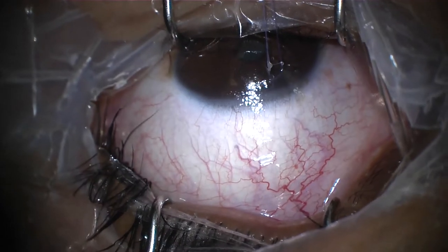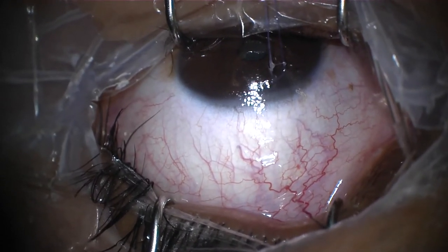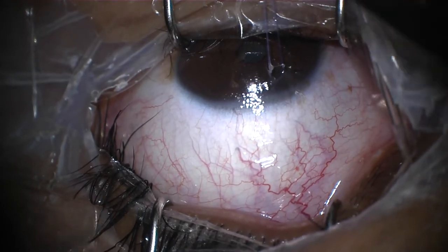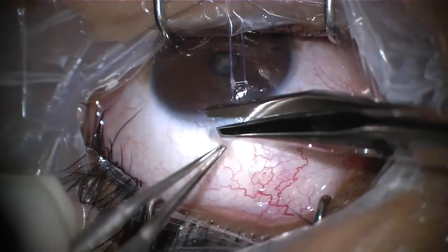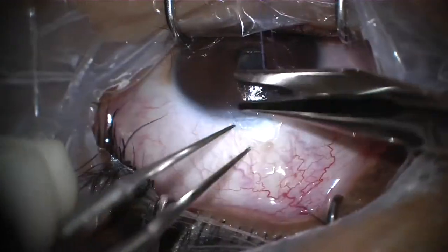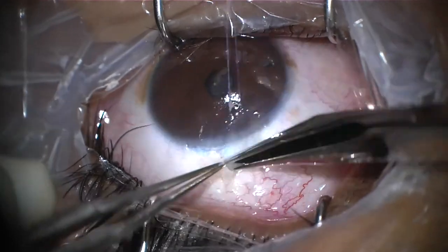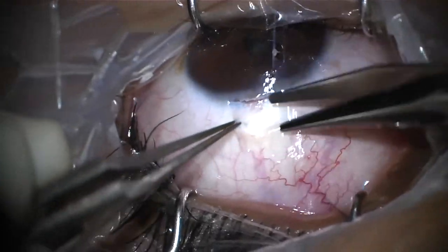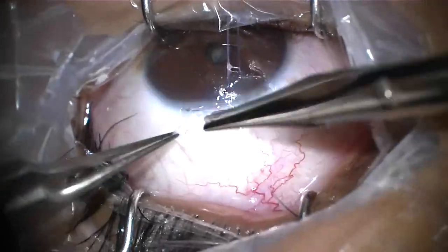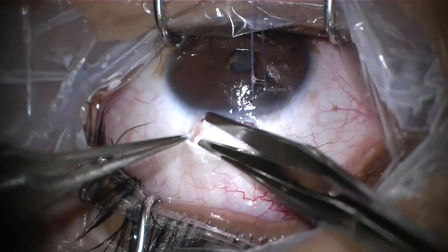This video presents a case of trabeculectomy with two releasable sutures. Subconjunctival mitomycin with lidocaine has been injected in the superior part of the conjunctiva, and a 7-0 Vicryl suture is placed as a traction suture to the superior part of the cornea. Then, using a Hoskins and a Wescott scissor, a fornix-based conjunctival peritomy is performed.